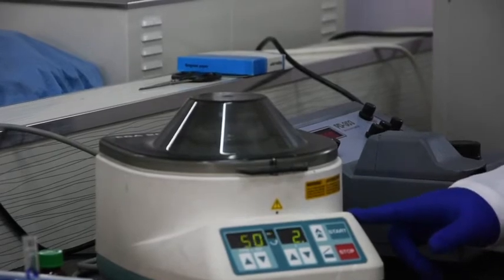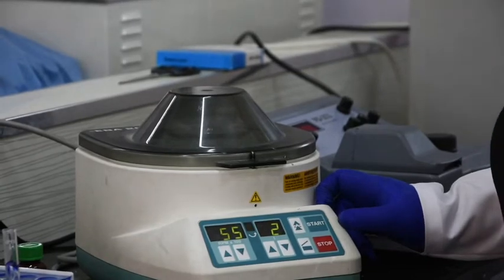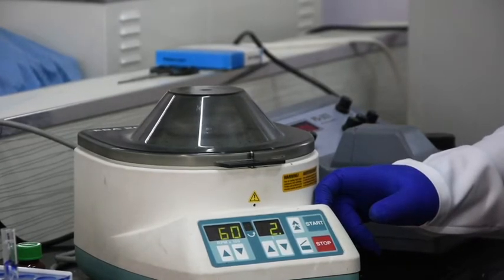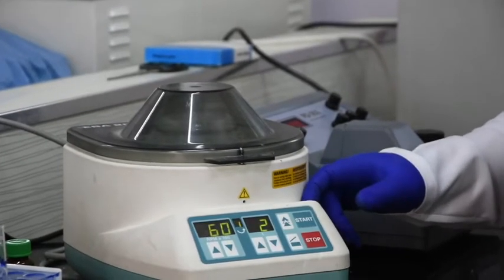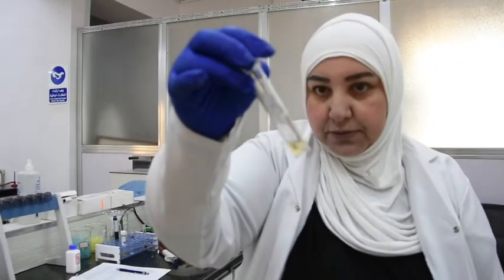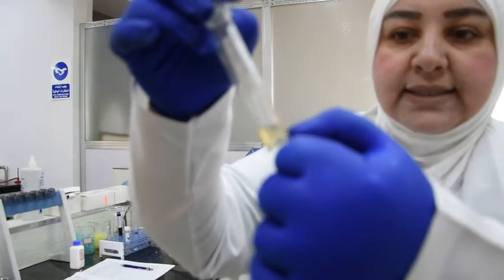This way, we get the supernatant and the parts of LDL, VLDL and chylomicron. The supernatant liquid has HDL cholesterol in the serum. After 2 minutes of centrifuge, we will have this. You see, the supernatant has HDL cholesterol.